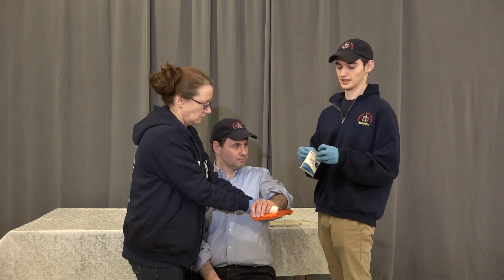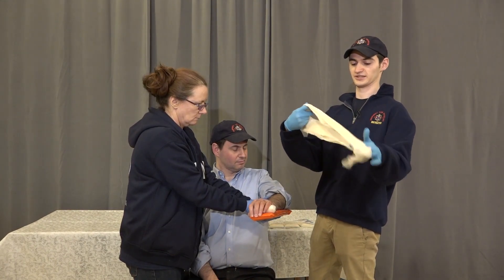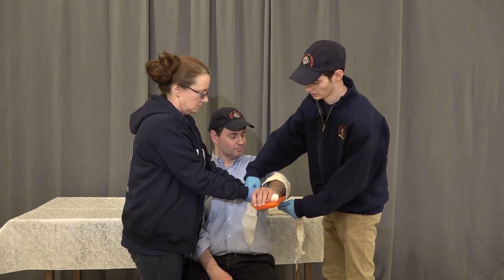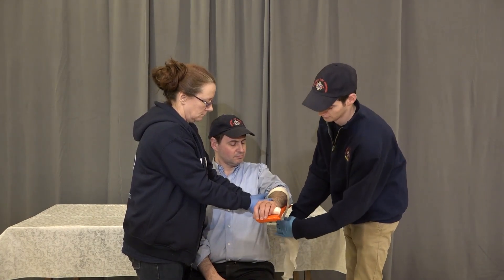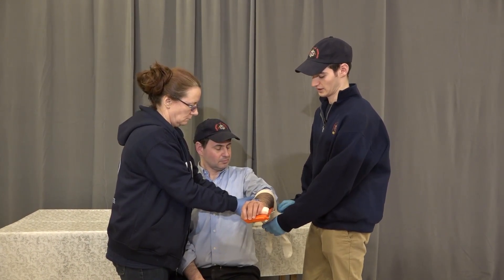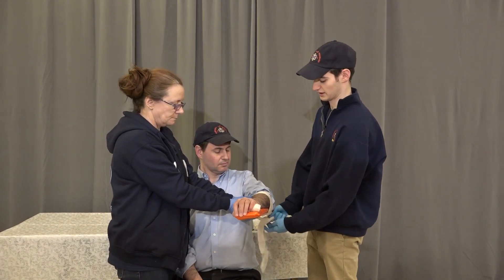We're going to take our cravats. Now we're going to secure the arm to the board. We're going to leave them nice and wide as they come. We're going to tie one at the top of the arm and we're going to tie surgeon's knots to make the knot extra secure. Tying on the board, nice and snug.